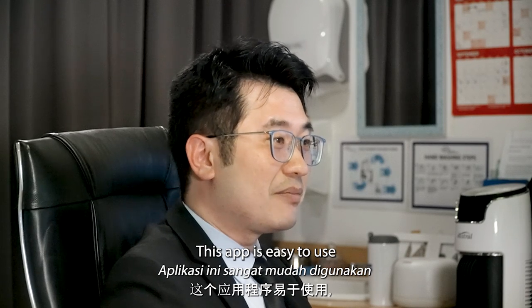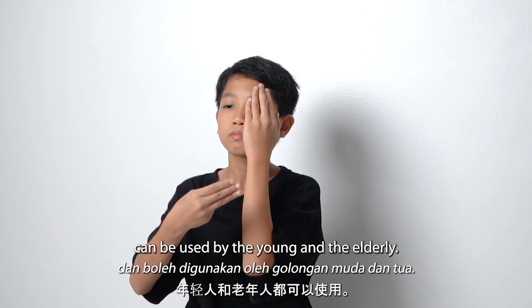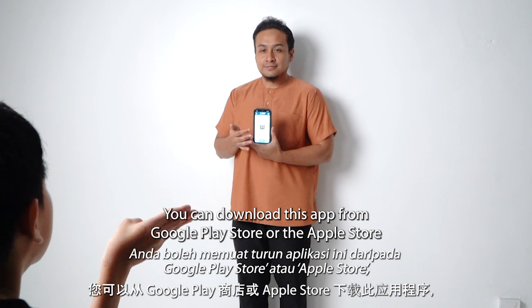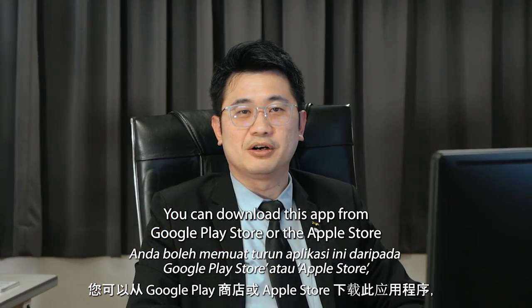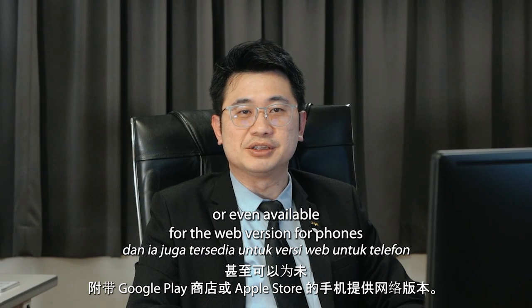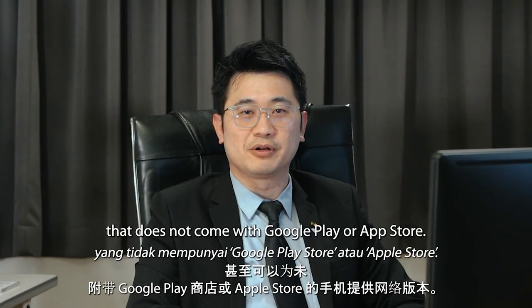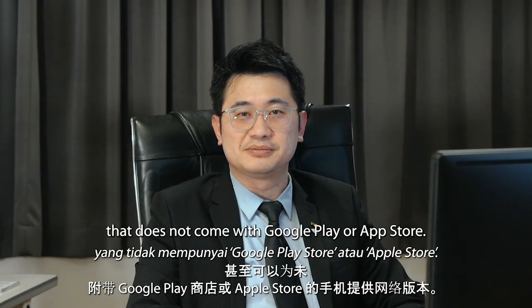This app is easy to use and can be used by the young and the elderly. You can download this app from Google Play Store or the Apple Store, or even the web version for phones that do not come with Google Play or App Store.